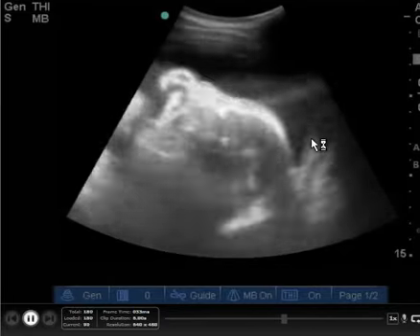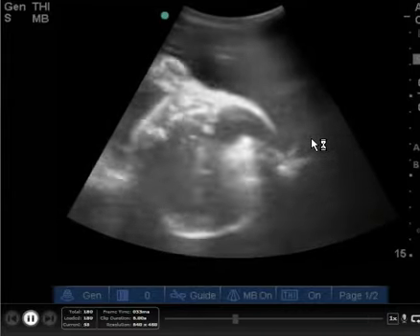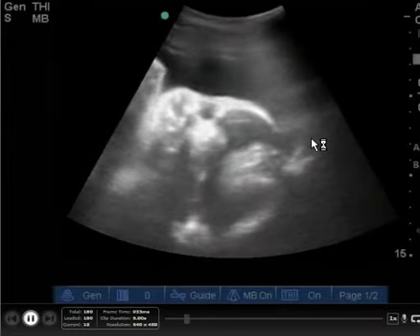Sometimes in pregnant patients, what can be helpful is that you put them in Trendelenburg, and then you look at the right upper quadrant. It makes the right upper quadrant a more sensitive finding if they're in Trendelenburg and there's still no free fluid. So, hope this helps.